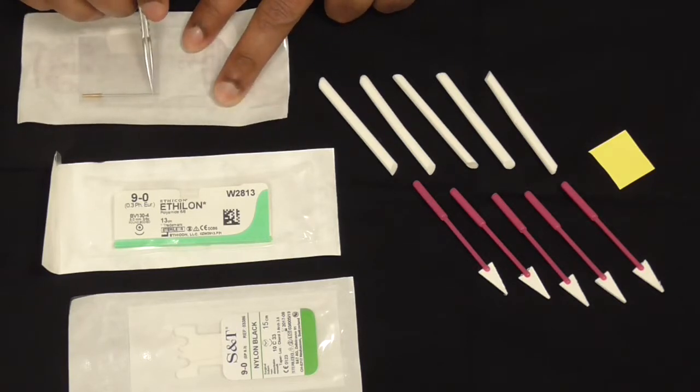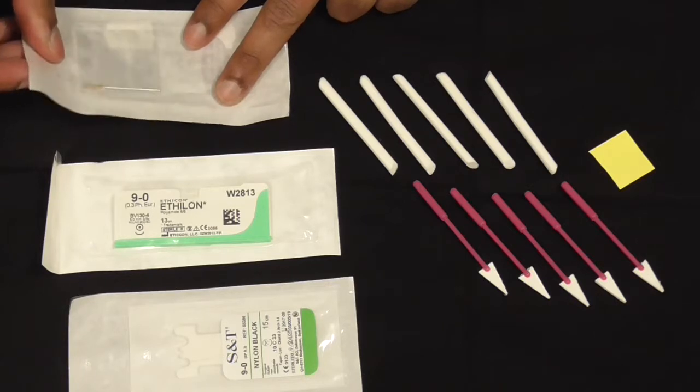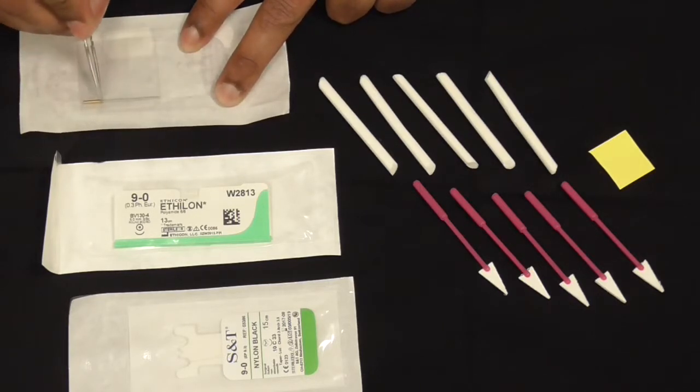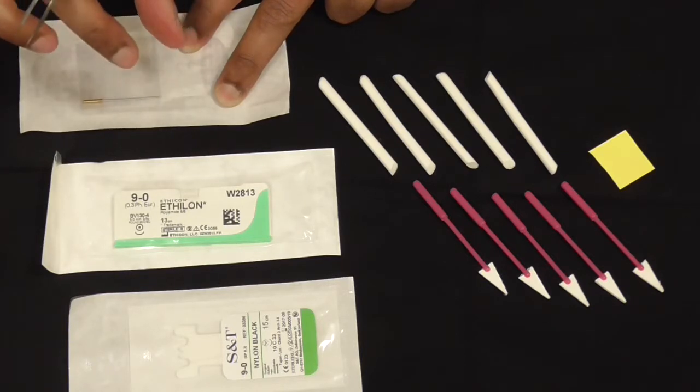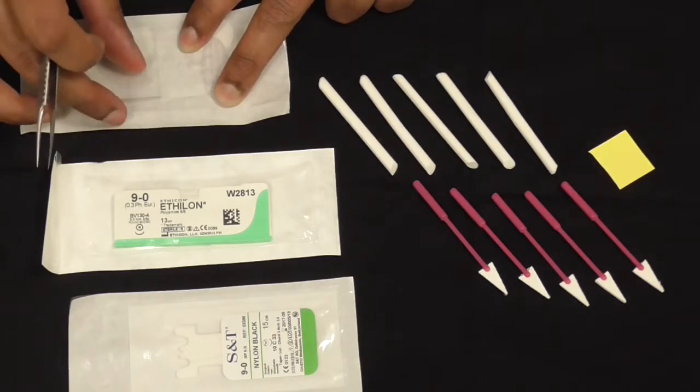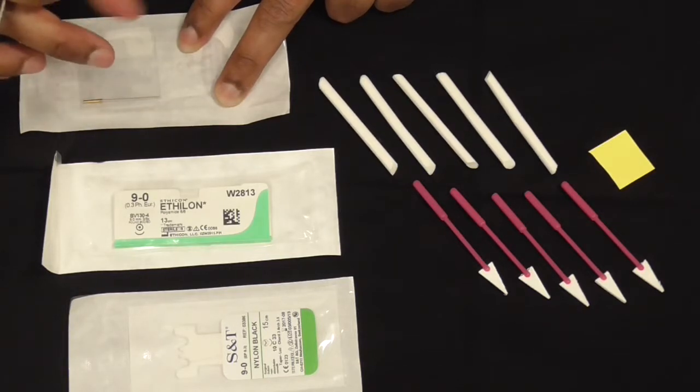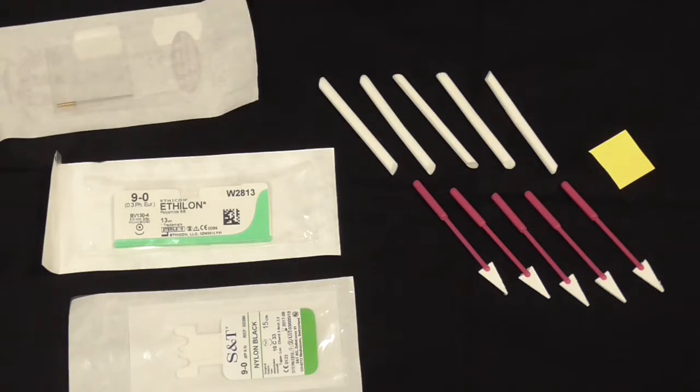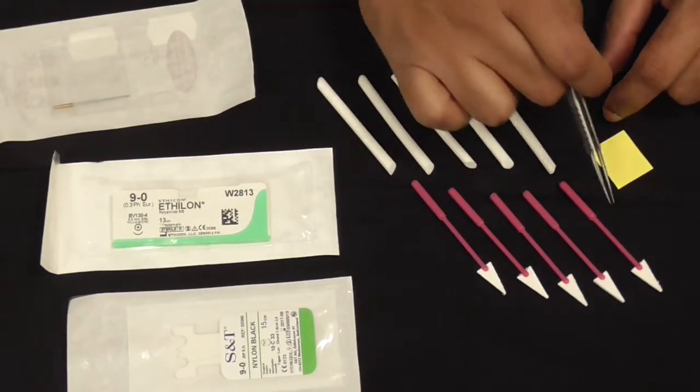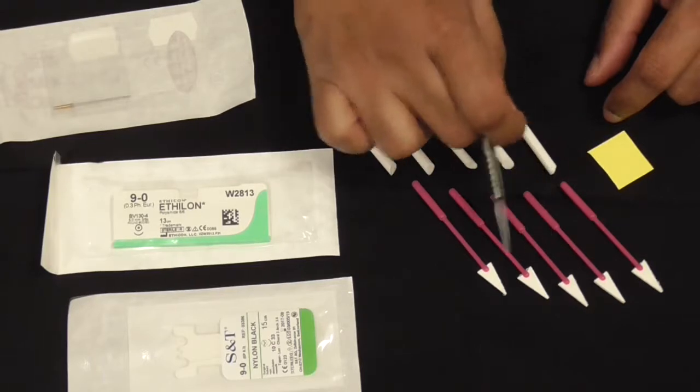The next thing that's quite useful is this little microsurgery suction tip. That goes into a normal suction tip and gives you a nice low-pressure sucking and irrigation. That's quite useful to have.